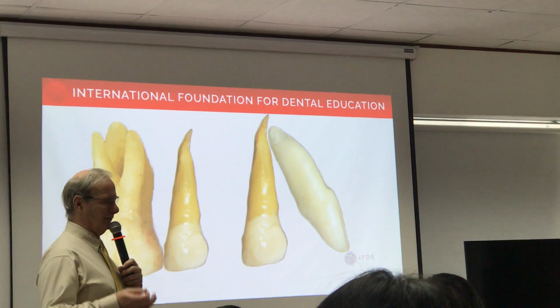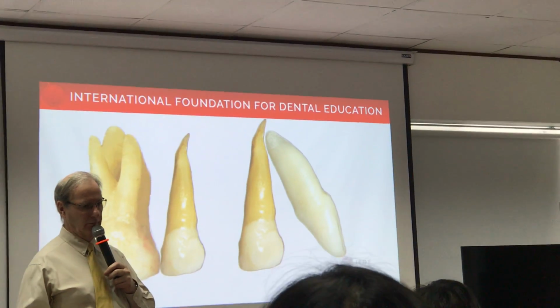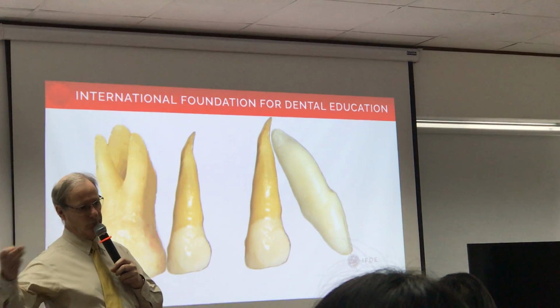And one trick is segmented is better to open the bite than straight wire. The vertical component of the segment system is way better. For the finishing, straight wire is way better.